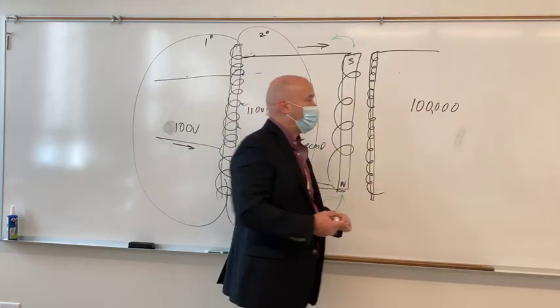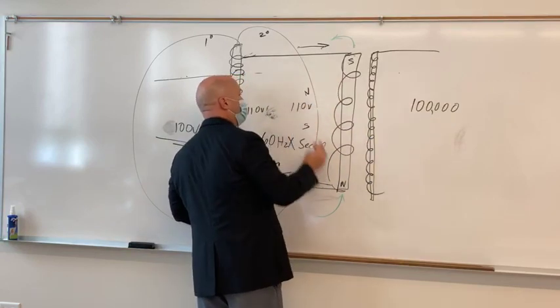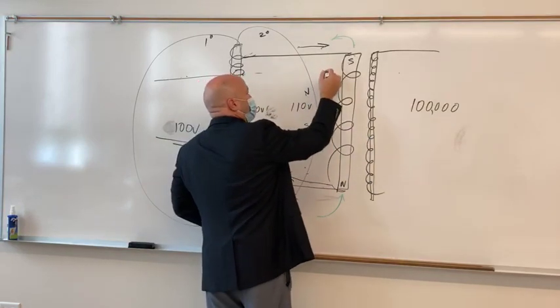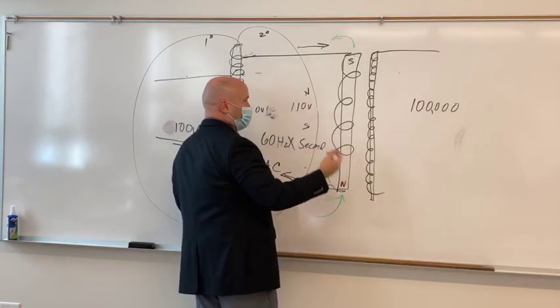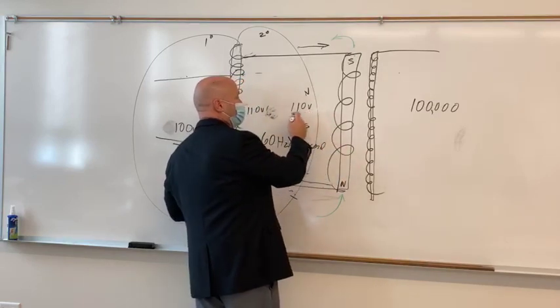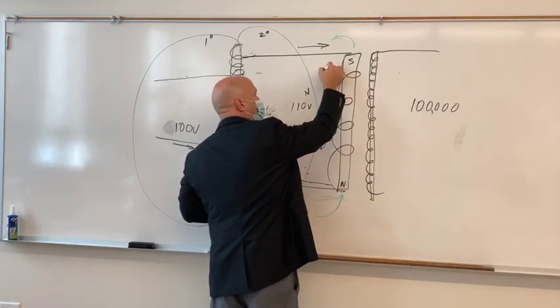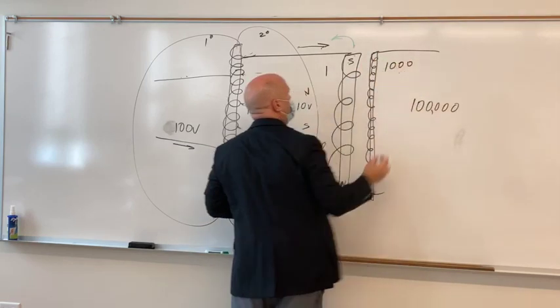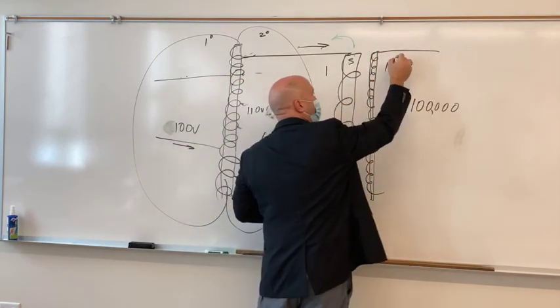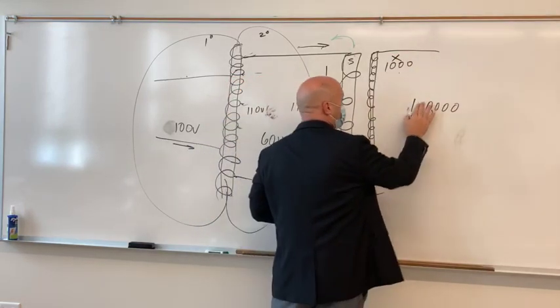And that's a ridiculous amount we need, because let's say we change this to 110 volts, and we'll work through the math here in a bit, but if we feed it 110 volts and we have a turns ratio of 1 to 1,000, what that means is that I'm going to have 1,000 times the amount of voltage on the secondary side.